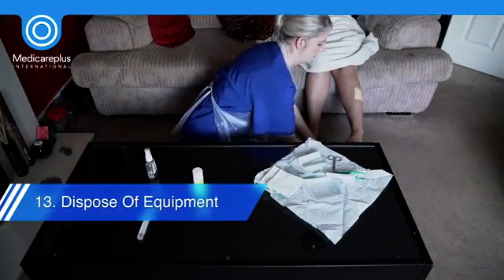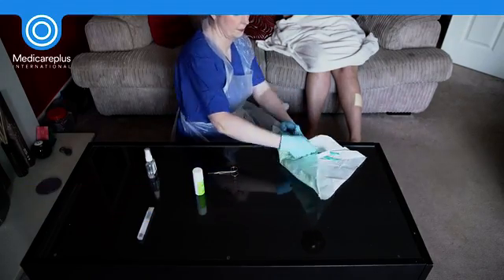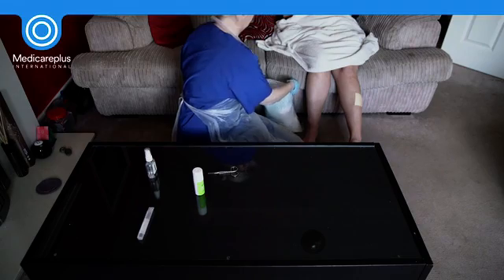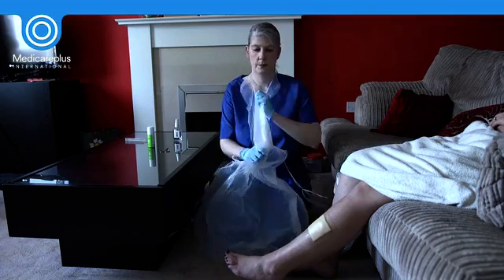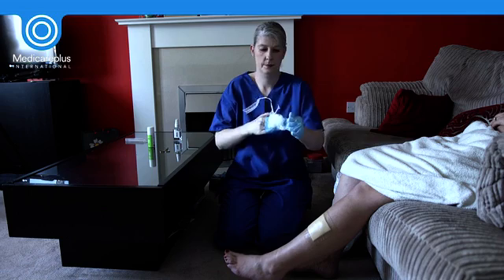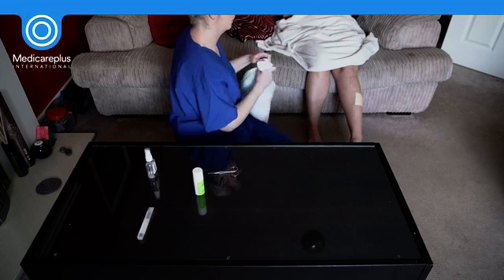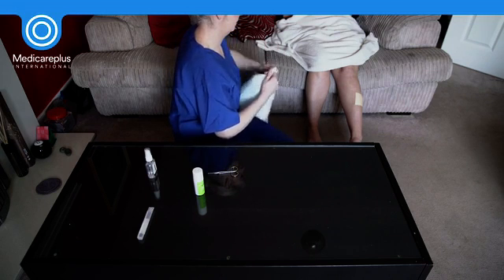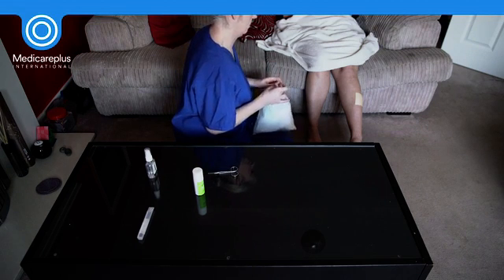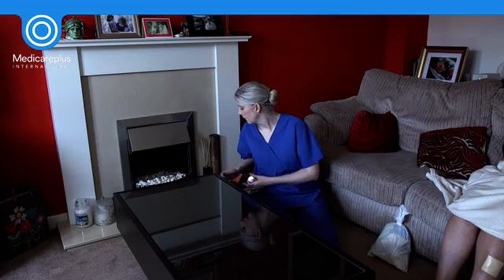When the wound dressing has been completed, remove your gloves and apron and dispose of all used equipment in accordance with your local trust waste policy. Clean down the working surface with a detergent wipe.